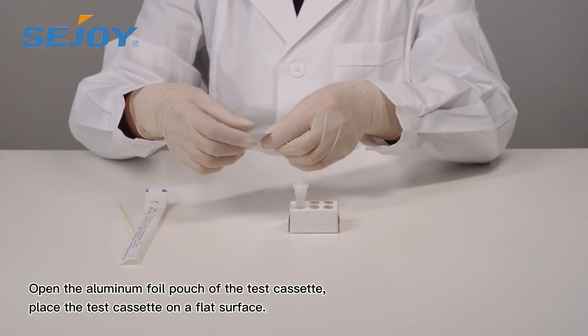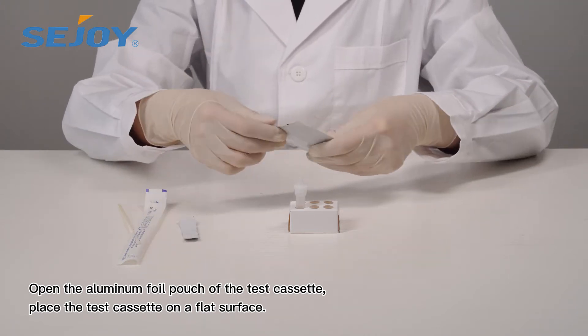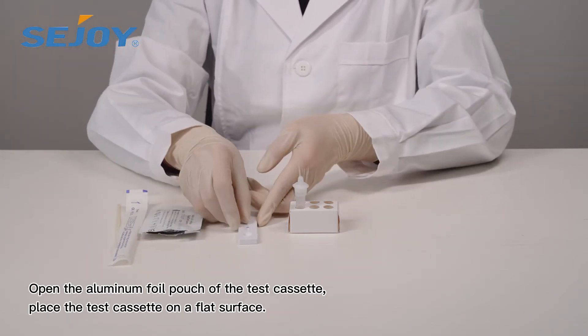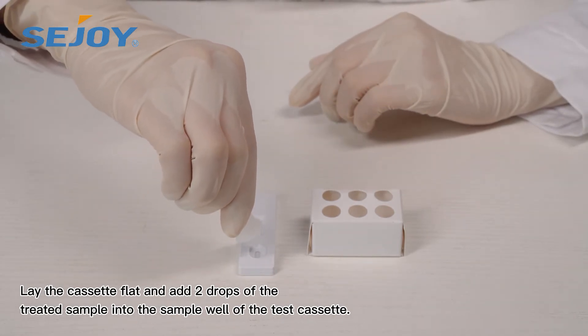Open the aluminum foil pouch of the test cassette and place the test cassette on a flat surface. Lay the cassette flat and add two drops of the treated sample into the sample well.